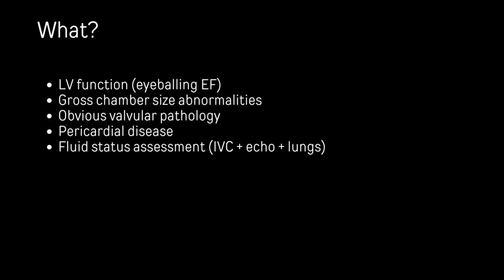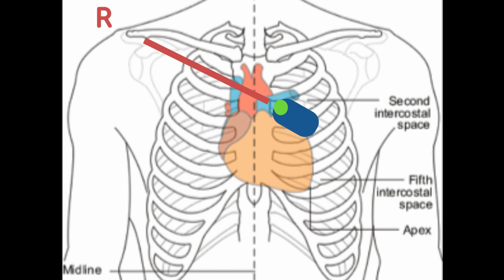Fluids, and when is enough fluids enough? And this is where ultrasound can really help you just to figure out, is it really going to be useful to give more fluids, and why are you giving the fluids? What's your endpoint?